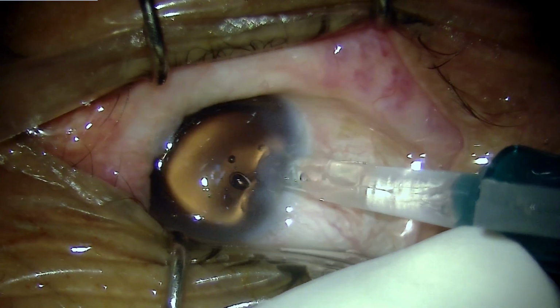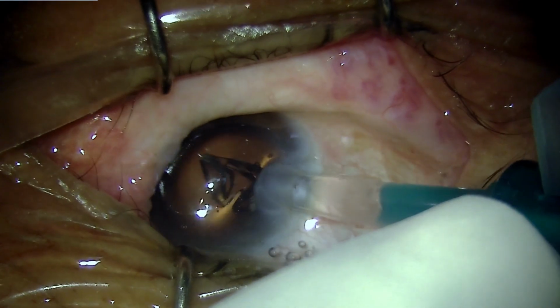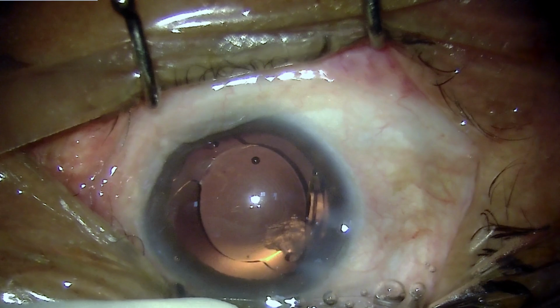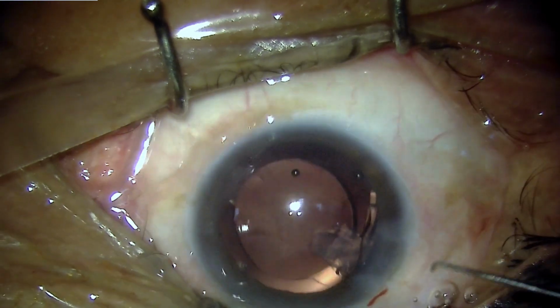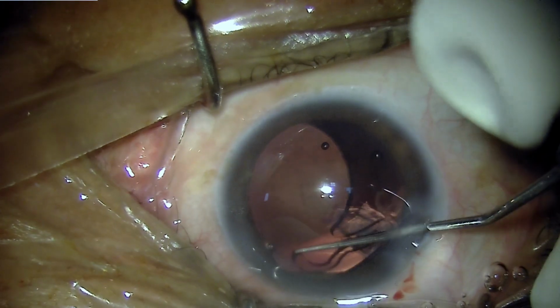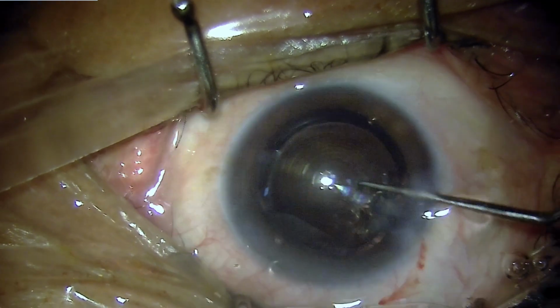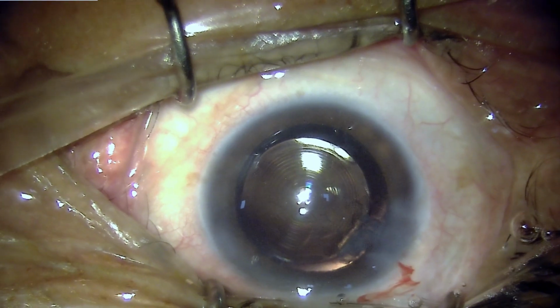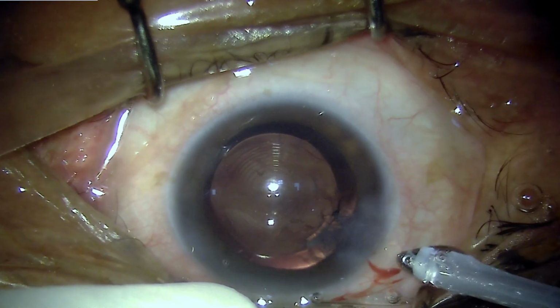and we can see it is a hydrophilic multifocal IOL, which has forgiving haptics, which I call because these haptics are more resilient to any damage and they are centered better. So because we can have access to the bag, the IOL is gone into the bag, and then you simply let the optic scoop up the remaining cortical matter so that it is lying above the IOL. And now we will remove this remaining cortex, which may be mixed with vitreous.